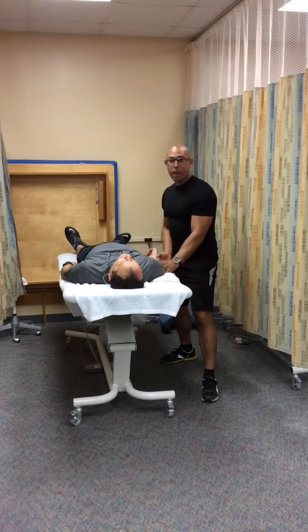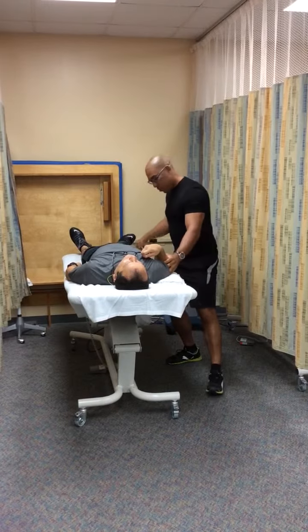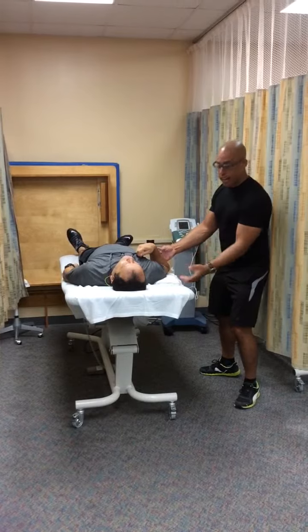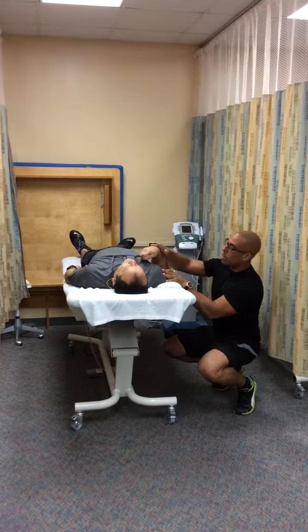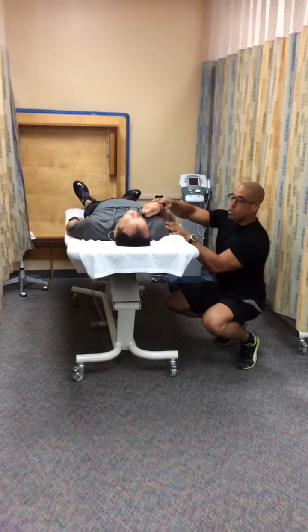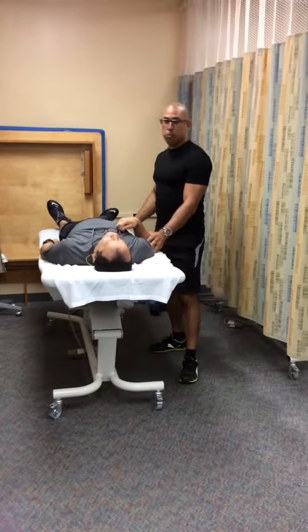I'm going to perform a passive range of motion. And I'm going to replace the goniometer using the previous landmarks and read and record. And it's 150 degrees. And this is a passive range of motion measurement.